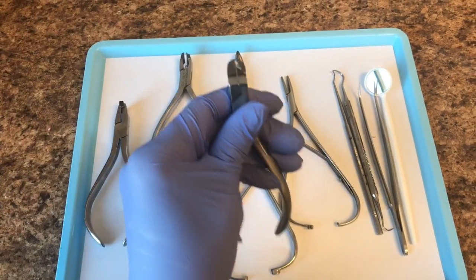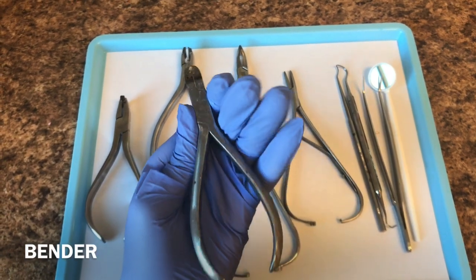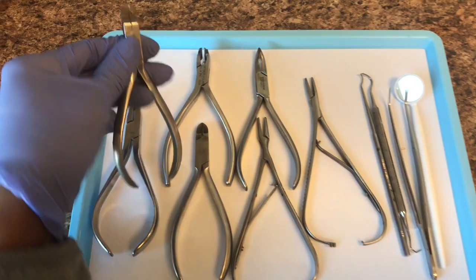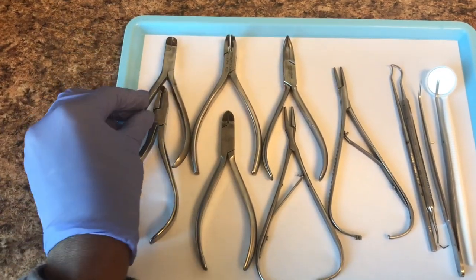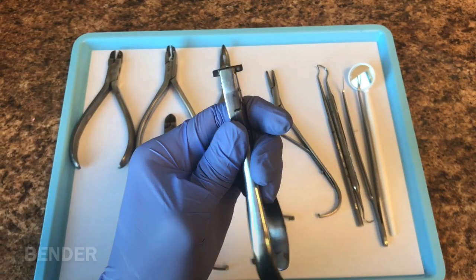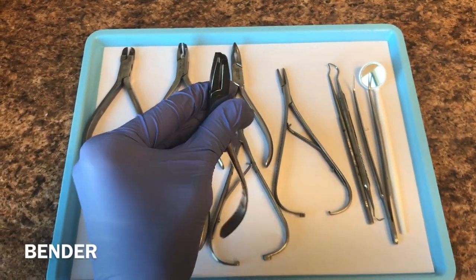Here is a bender, which is basically just used to place bends in the wires. And here we have a stepper, and this is used to place steps in the wires.